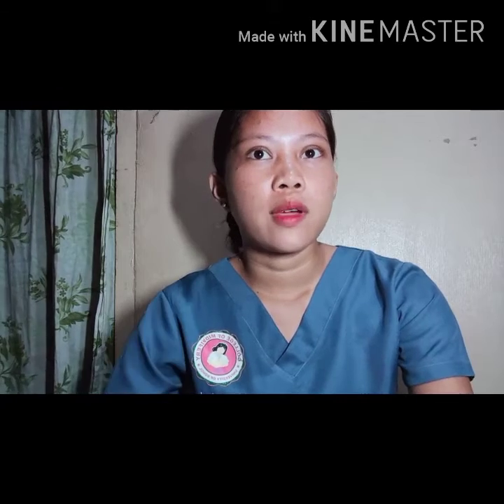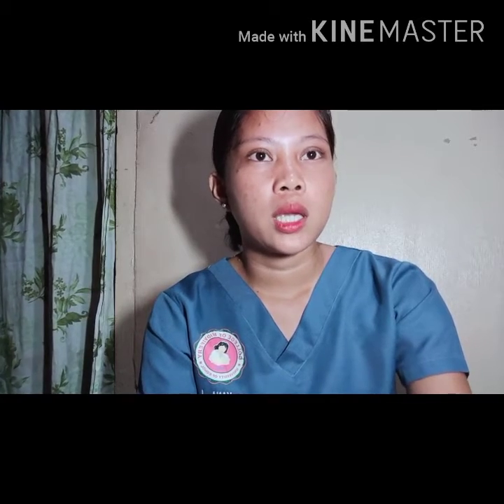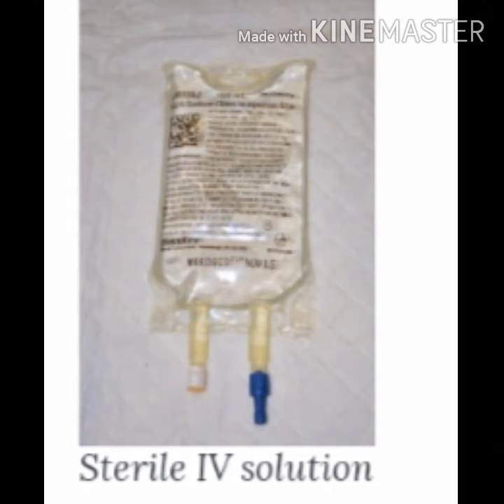I-check nimo kung unsay order nga maka-verify solution unsay rate and frequency. This ensures IV solution is correct and helps prevent medication error. So by checking order to verify solution rate and frequency will help to ensure IV solution na correct siya and di makaprevent pud ka og medication error. So after checking order, you gather your supplies or equipment. So this will need IV solution, primary IV tubing, time label, alcohol swab.